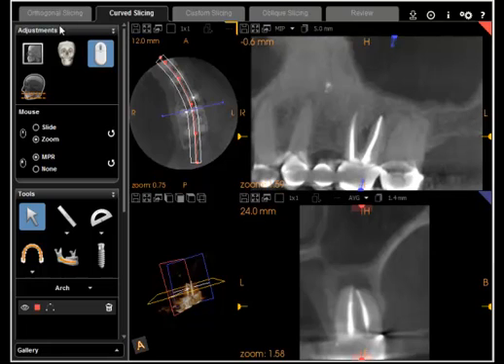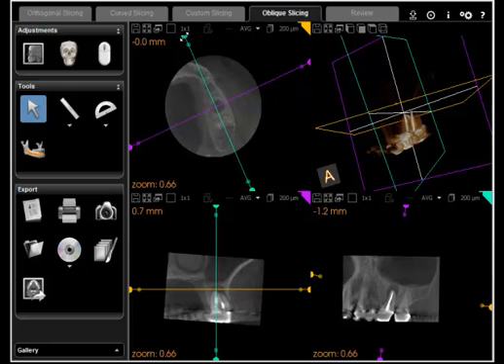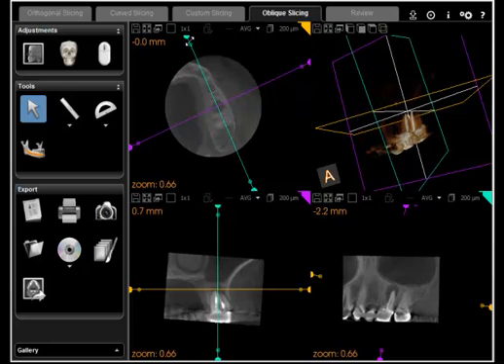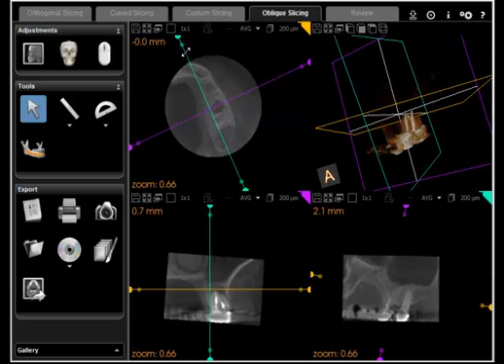Probably the most useful tab in the software to visualize endodontic anatomy and pathology is the oblique slicing tab. When you click on that, you get the three basic views: the axial, the coronal, and the sagittal view. As you saw in the earlier videos, by mousing over any one of the semicircles and holding the left mouse button down, you can move the position of the sagittal slice back and forth.